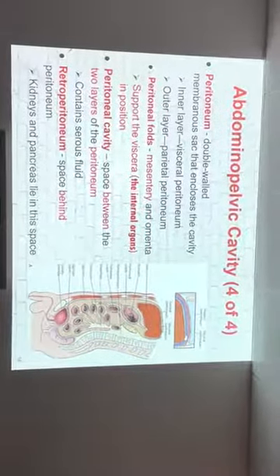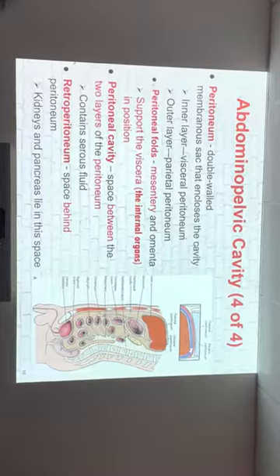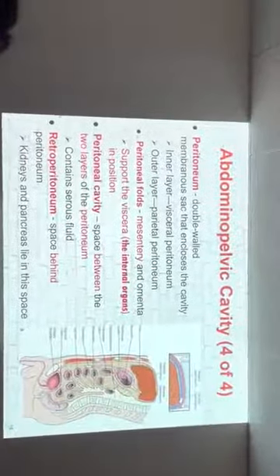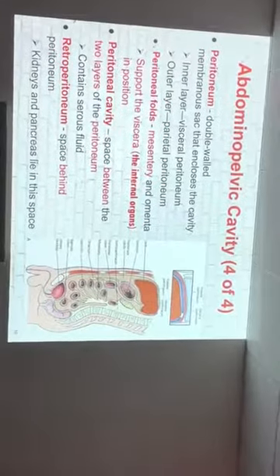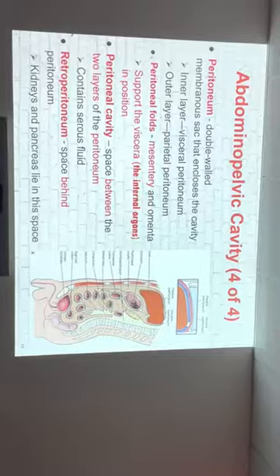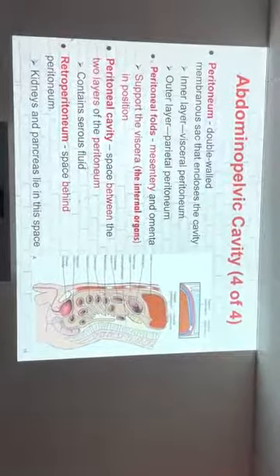But I used to have copies of those X-rays, and they have since deteriorated because it was actually on real film, and X-ray film does not last forever. That was like a million years ago, and the images have deteriorated, but I wish I could show those to you because you can see it clearly. It's a wide bottle. Like, it's not a skinny bottle, it's a wide bottle of shampoo. It's huge.